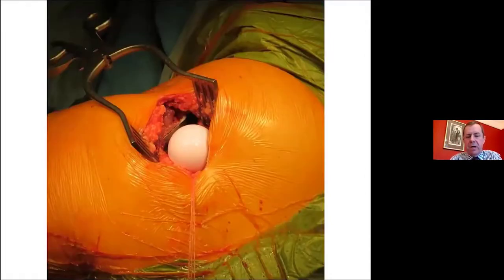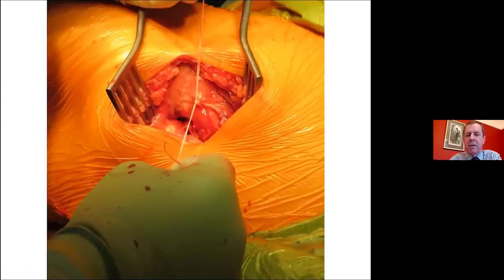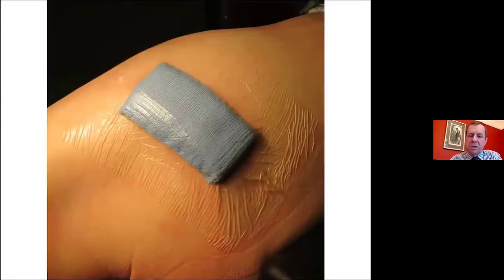And that's just before reduction. These sutures here are some non-absorbable sutures in the short external rotators and the capsule to effect a repair at the end, like that. The dressing I use is a vapor permeable waterproof membrane, which goes on in theater. My closure is Monocryl and glue, and that dressing stays on for 2 weeks. And most of the nurses within about 50 miles of where I work know that they must not touch those dressings. And I do let the patients have a shower with them on.